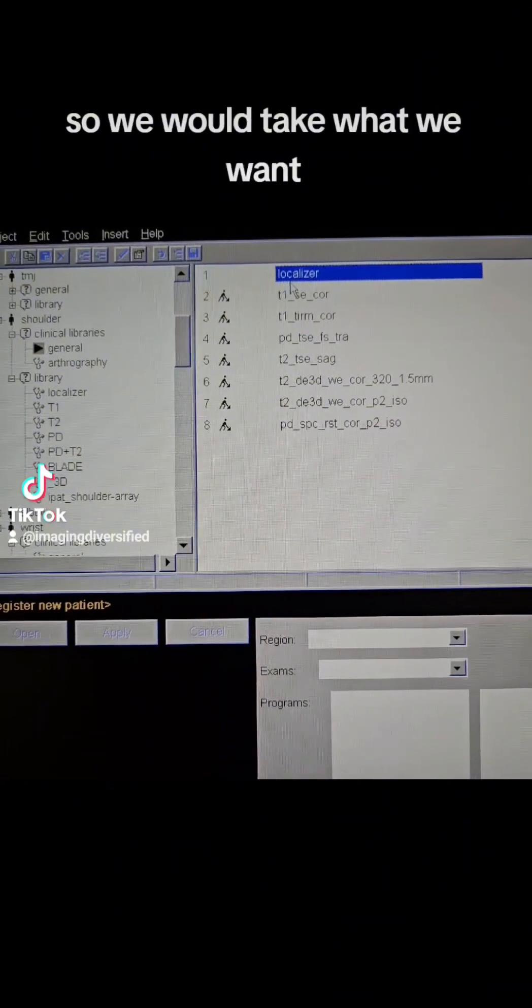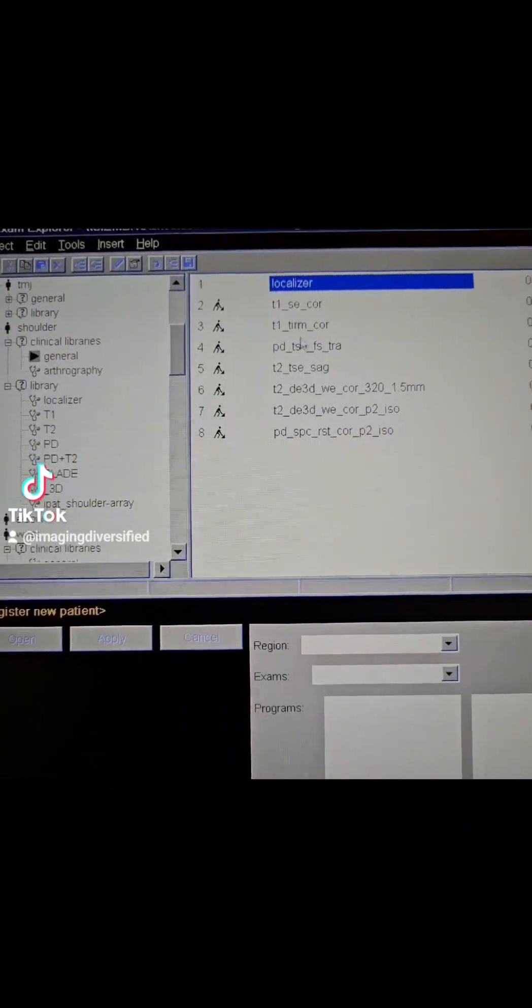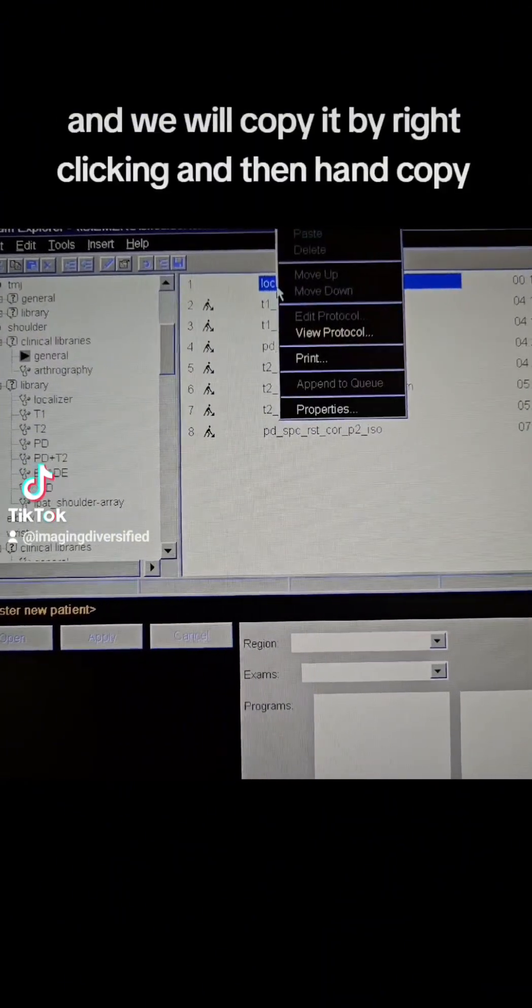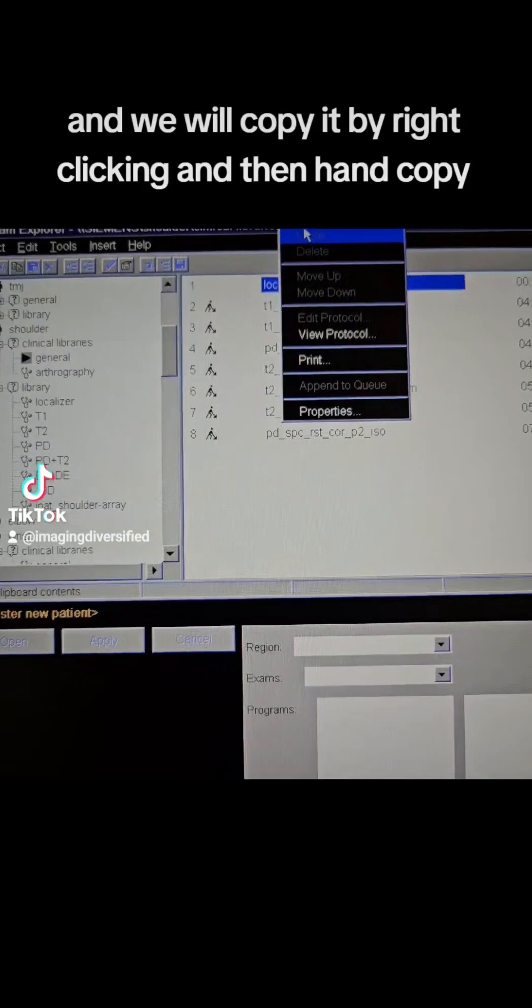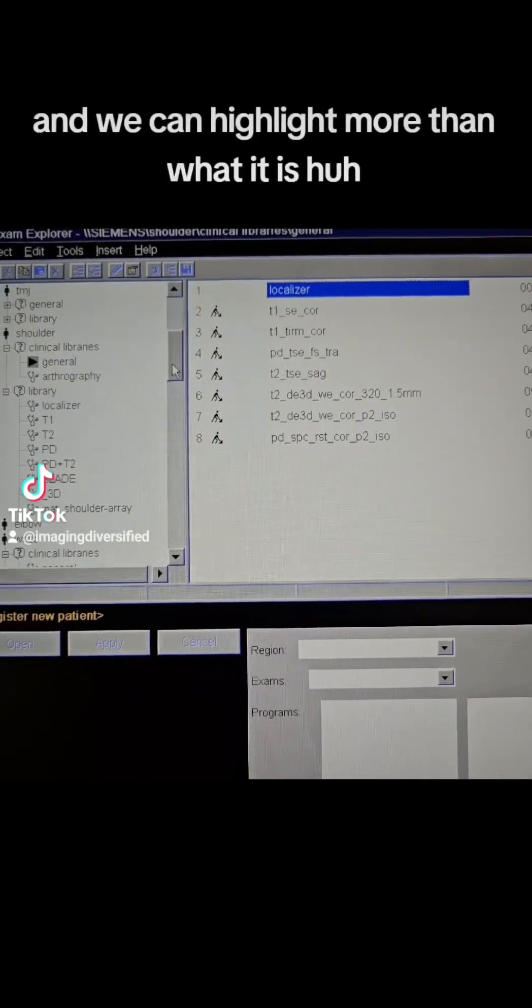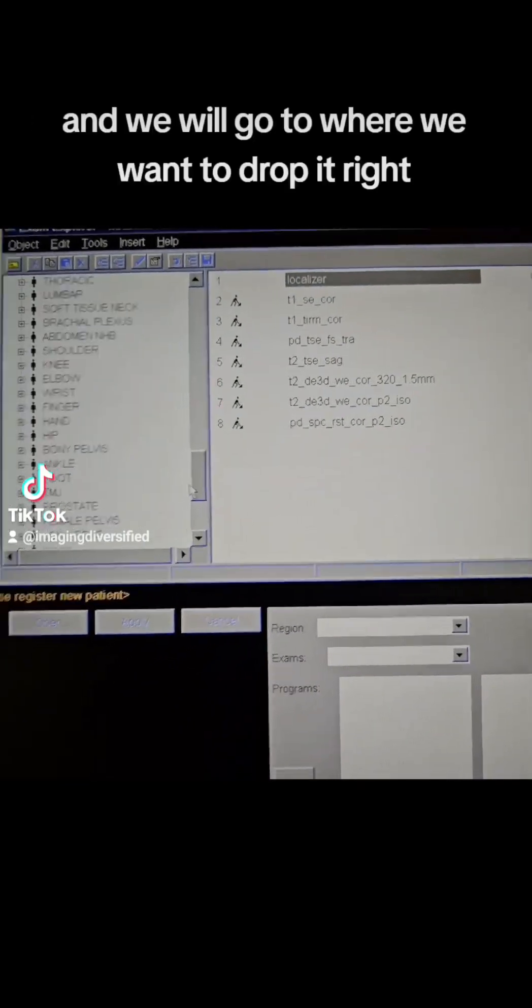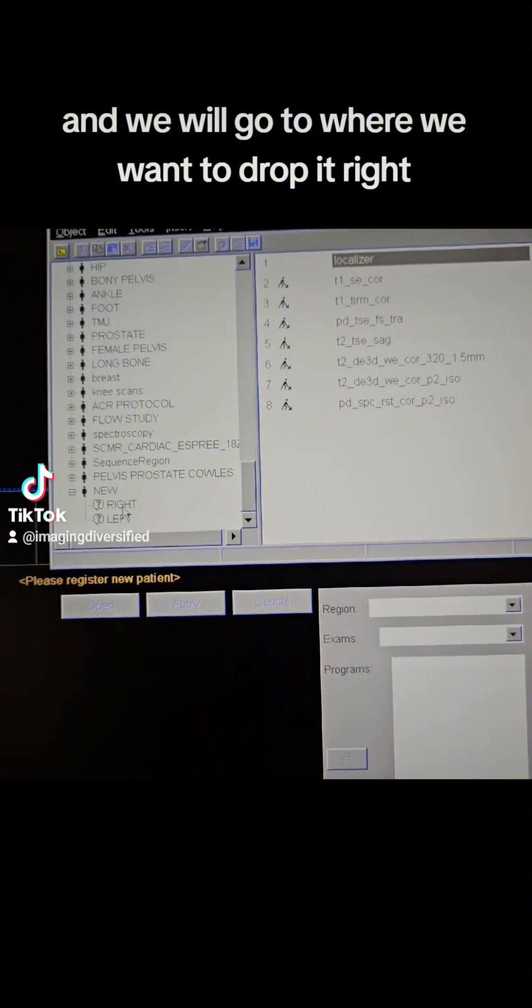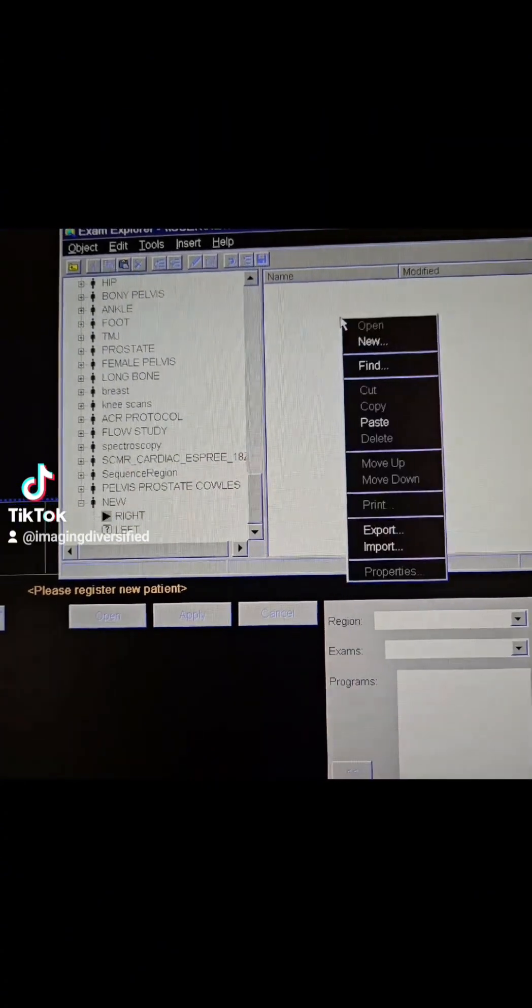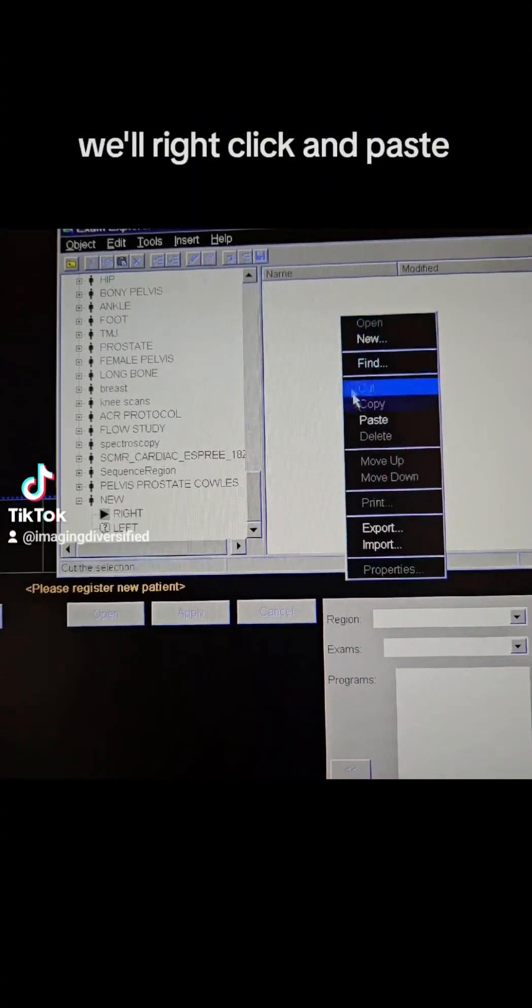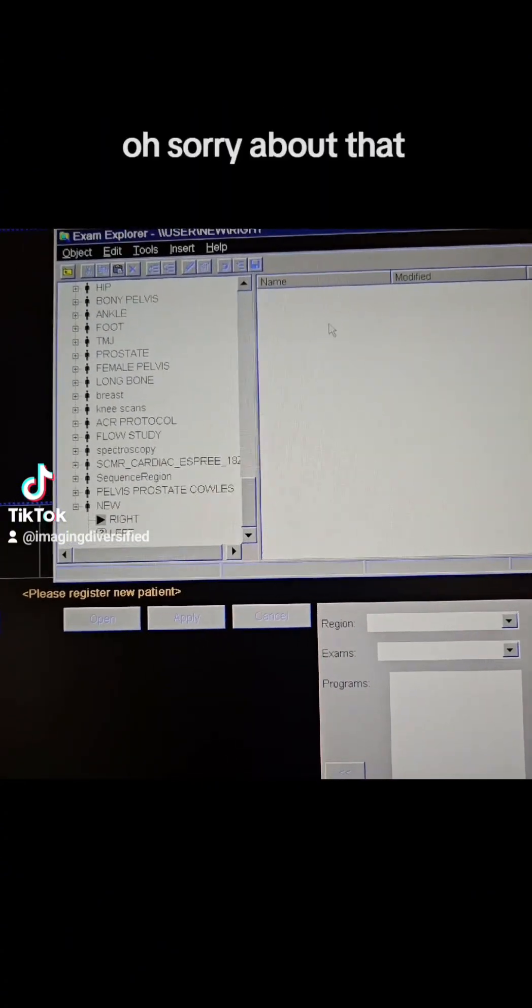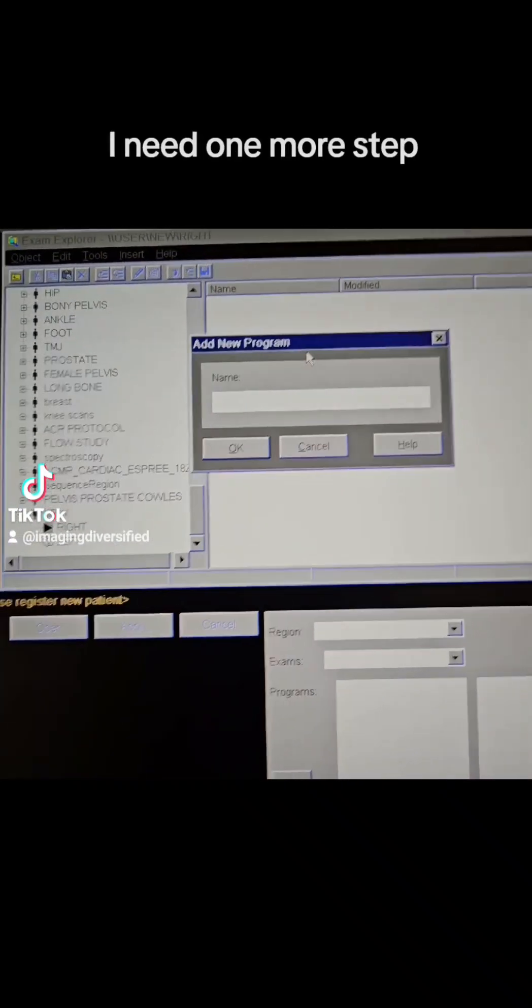So we would take what we want, and we would copy it by right-clicking, and then hit Copy, and we can highlight more than one at a time. And we would go to where we want to drop it. We'll right-click and paste. Oh, sorry about that. I needed one more step.